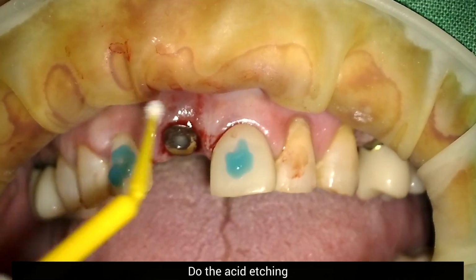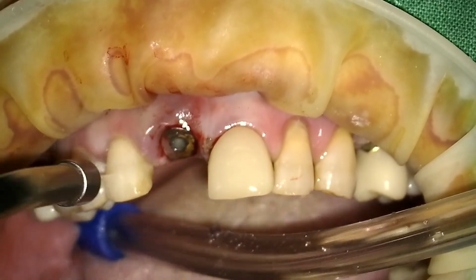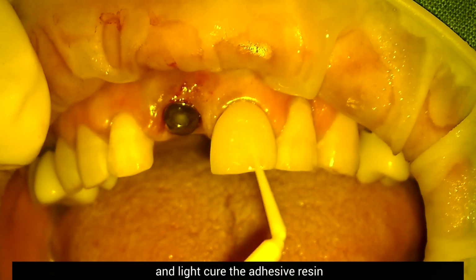Do the acid etching and light cure the adhesive resin.